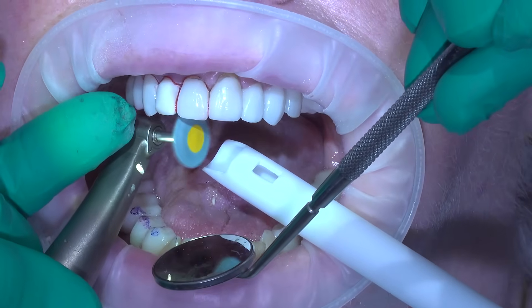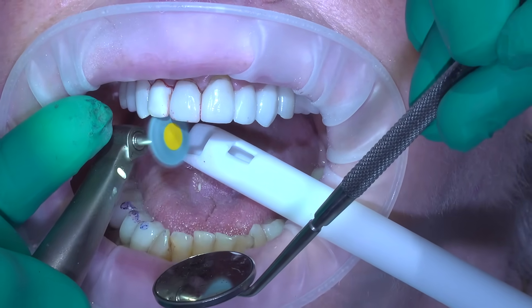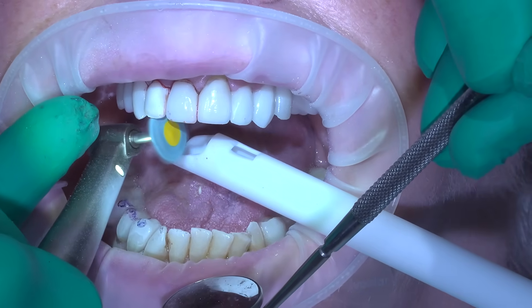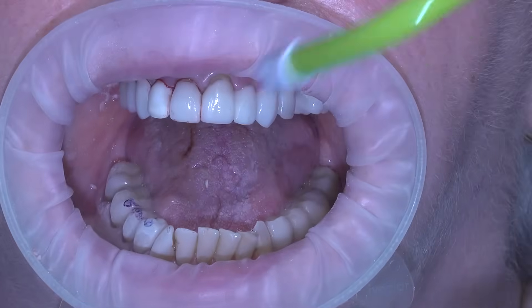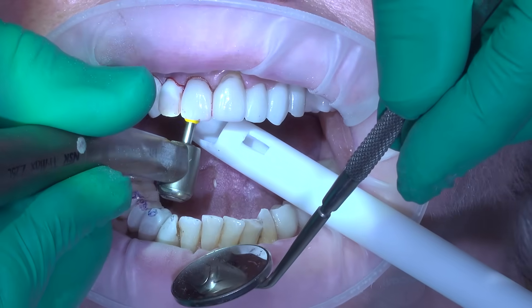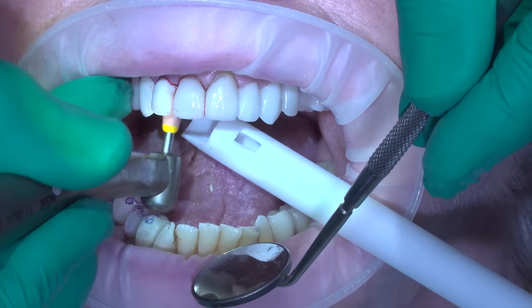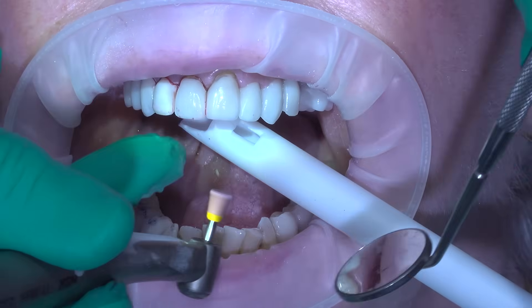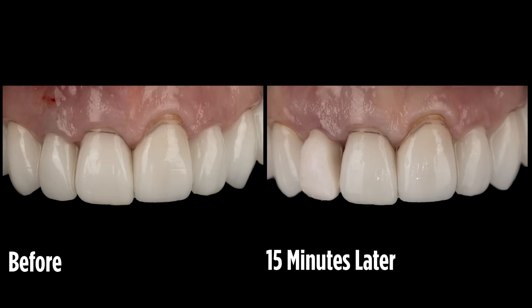Now I'm definitely futzing — coming in to make the inside smooth. Now we're coming in with a cup. I actually really like the cups — they're small enough to get into places, and the cup design gives a really good polish. On the left is before, and on the right is about 15 minutes later when we took the final photo. Remember — maintain, not regain. That's our objective with these cases, especially in the aesthetic zone. I would never do this in the posterior. Behind the smile zone, I'm not doing this immediate provisionalization on a molar. It's only in the aesthetic zone.